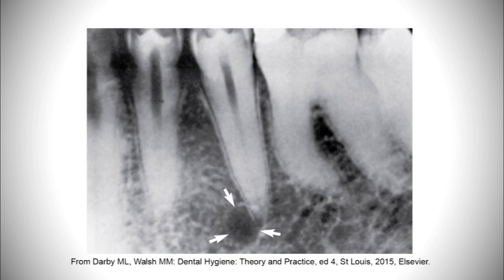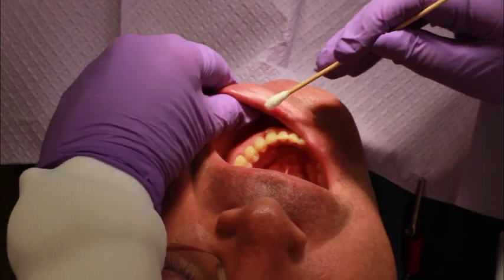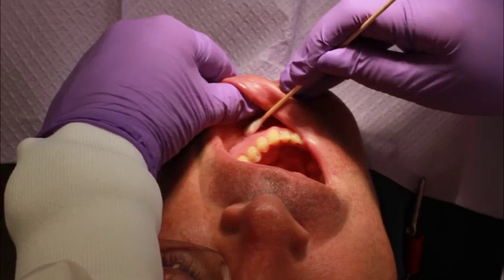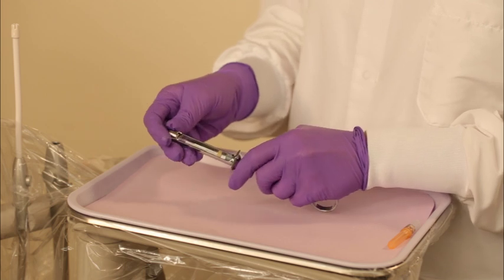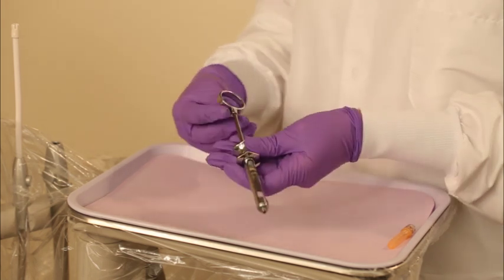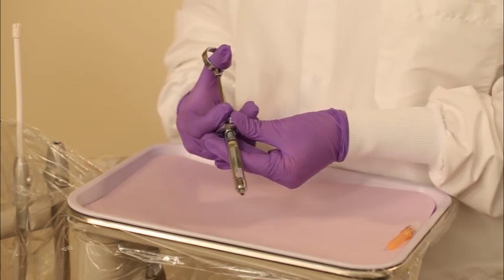To locate the mental foramen for the mental block, palpate with a cotton tip applicator intraorally the depth of the mucobuccal fold between the apices of the mandibular premolars or at a site indicated on a radiograph until you feel a depression on the surface of the mandible surrounded by smoother bone. Load the local anesthetic syringe as demonstrated in the procedure, loading the metallic or plastic cartridge type syringe. Before injection, follow all steps as demonstrated in the procedure, basic injection technique.